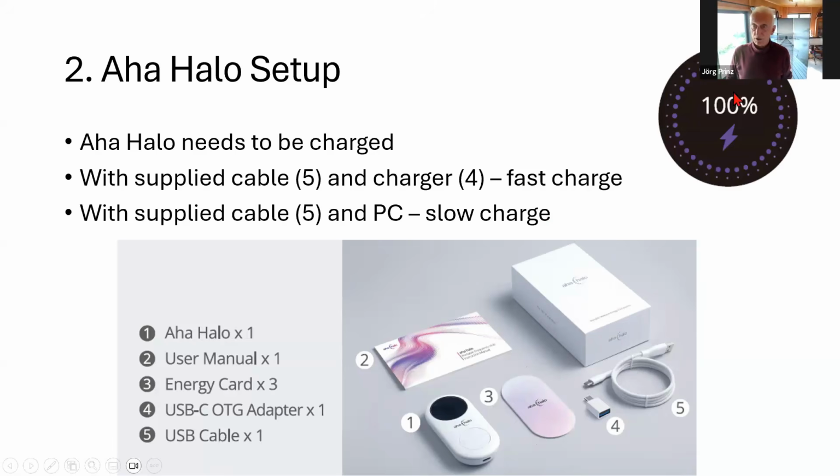When the device is fully charged, you see 100% mark there. It's quite astonishing how long the battery actually lasts. So I've got very good experiences with that.